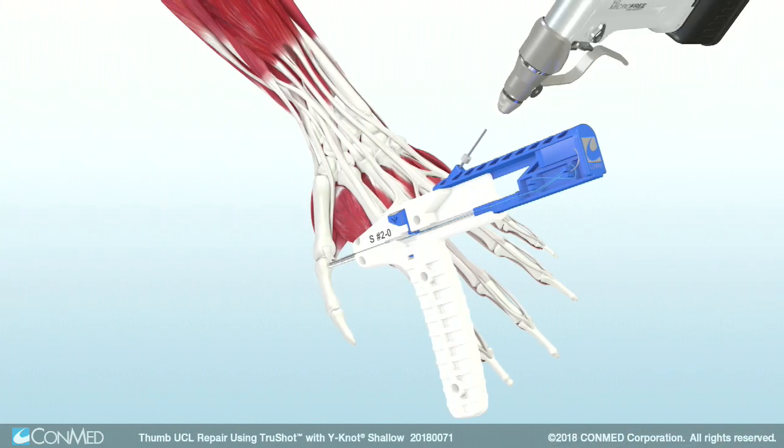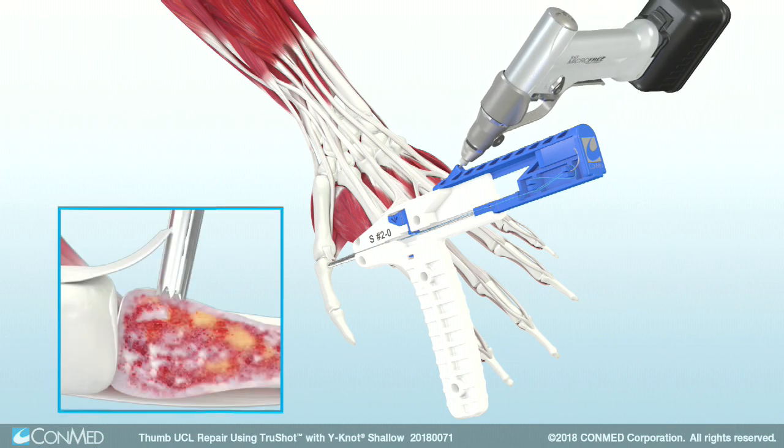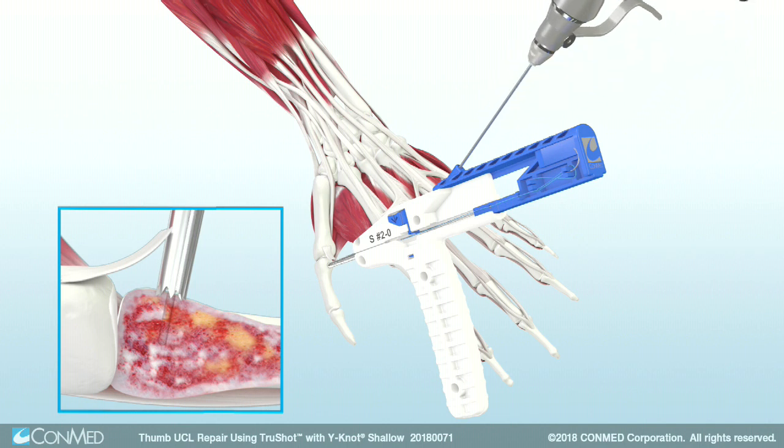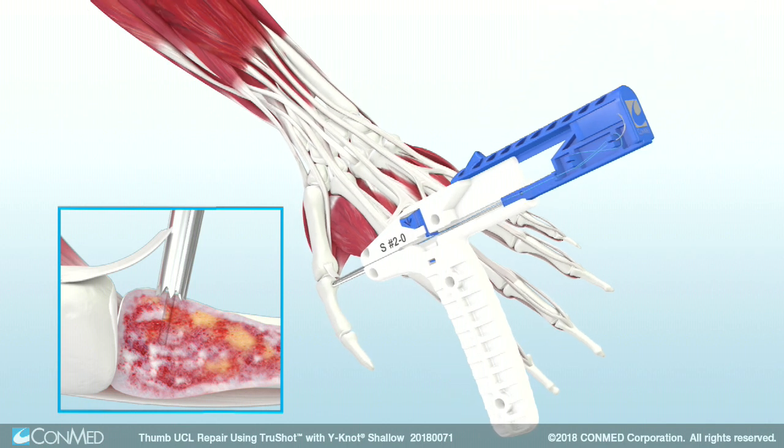Use the Hull MicroFree Mini Driver to advance TruShot's drill forward until the hard stop is engaged. The hard stop provides an exact 10mm pilot hole depth for the shallow anchor profile. Once the hard stop is engaged, completely remove the drill from TruShot.